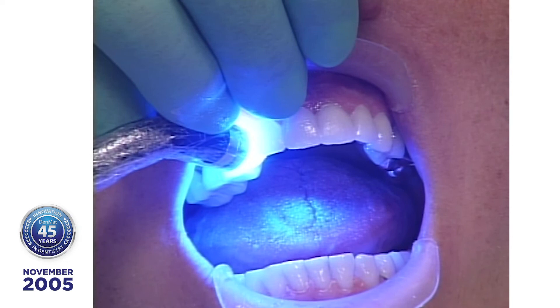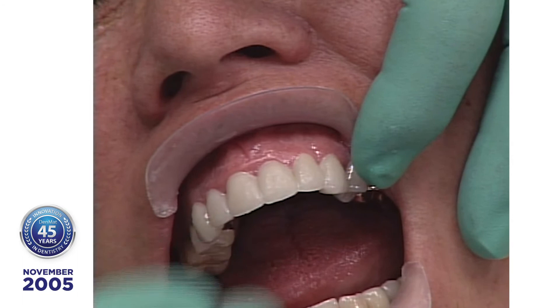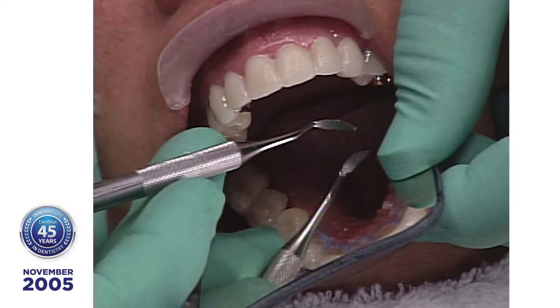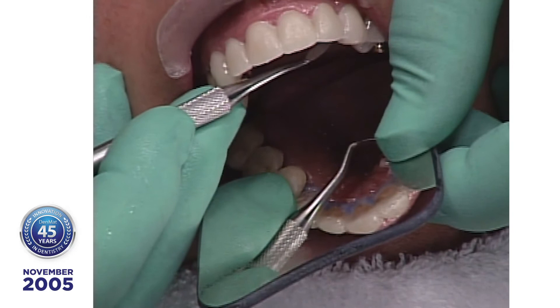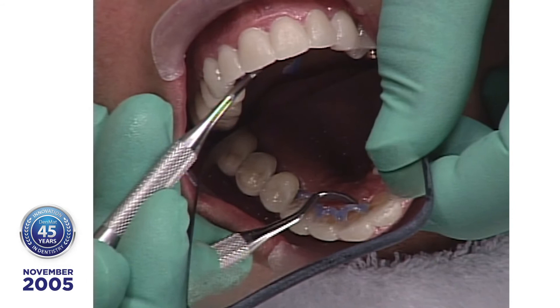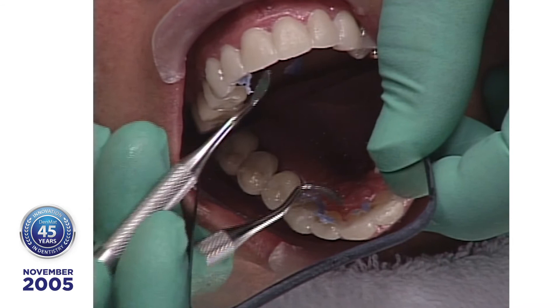Now we can sort of relax because we have bonded these. Let's see what it looks like on the lingual side with the mirror — looks just like it did before. Now I'm going to start taking the paint-on dental dam out. I'm going to check and make sure that these margins are all taken care of. And we're done — you can send the patient home now. Tell them if they brush, the ultrabond will flake off and you can have them back.